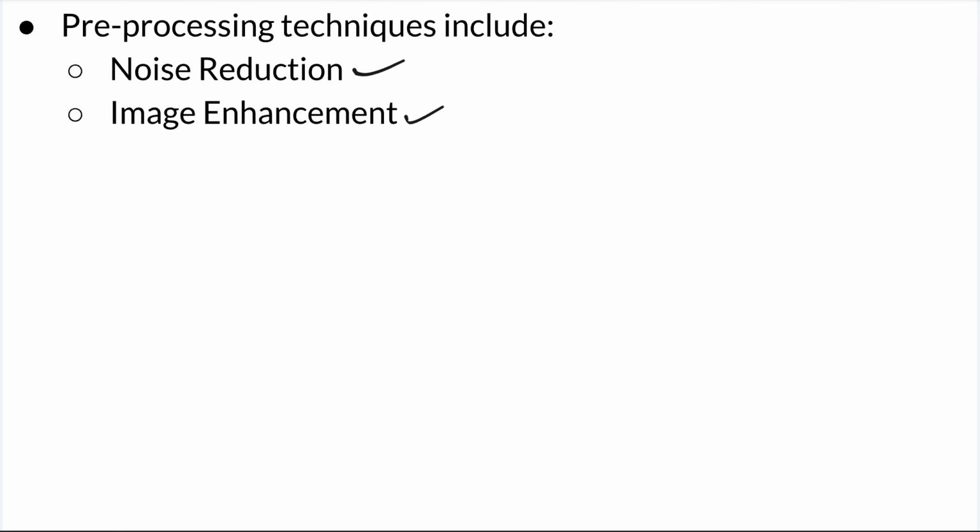And you will attest to the fact that when you are taking a scan, some of the noise that you see in your scan comes from the patient, right? So we have the patient, when the patient is moving, able to generate noise. Sorry, patient moving. Then also noise from the device itself, whether it's the CT scan or whatever, they also have internal noise that they generate.